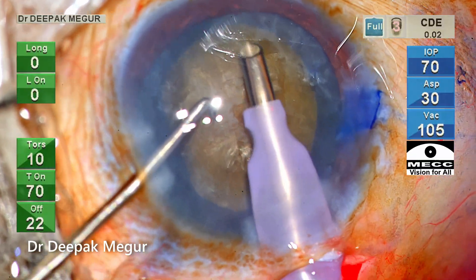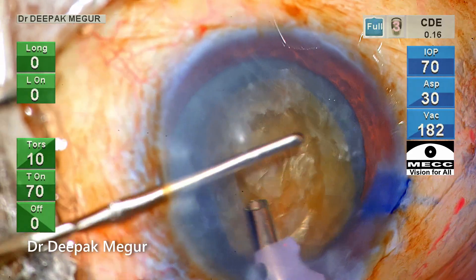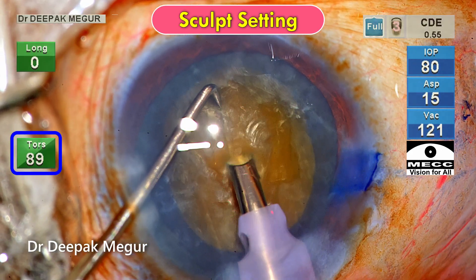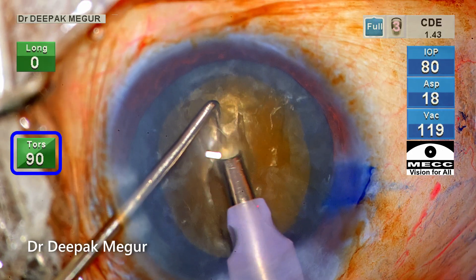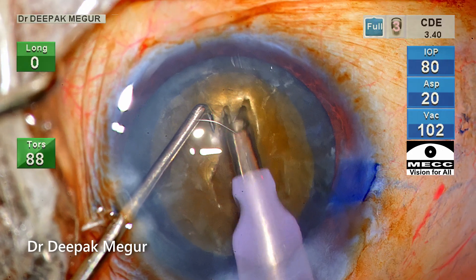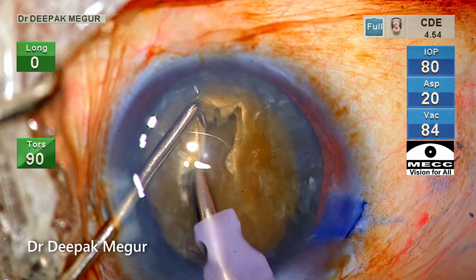Time to emulsify the nucleus. After initially aspirating the overlying cortex and the epinucleus, I switch to Sculpt mode, using 90% torsional energy to make a central deep trench. Please note my second instrument is stabilizing the nucleus as I'm trying to create a deep trench in the central part of the nucleus.